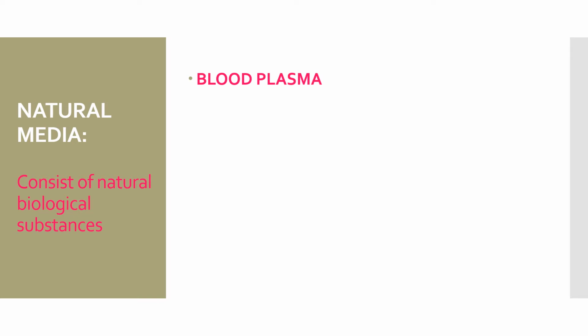So plasma is still being used for conditioning the medium and to provide a nutritive substrate and a supporting structure for many types of cultures, just like it provides a matrix for new cells during repair of injured tissues in the body. It is also used to provide a means of conditioning for better attachment of cultured cells to substrate and to provide a means of protecting the cells and tissues from trauma during subculturing.